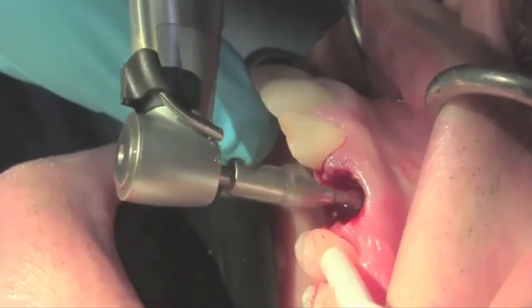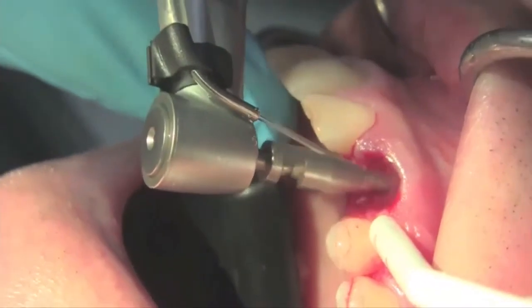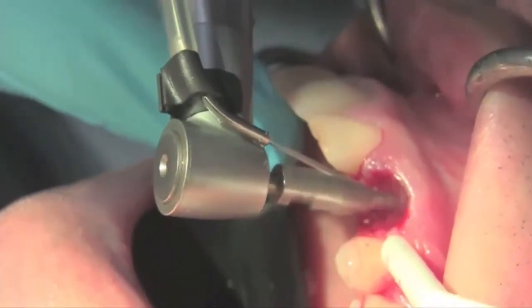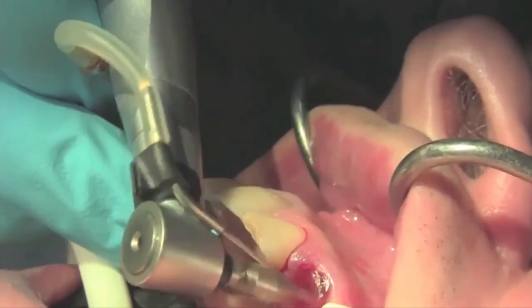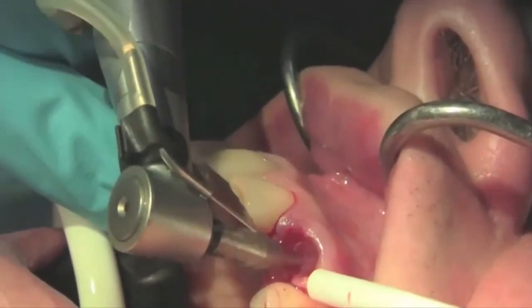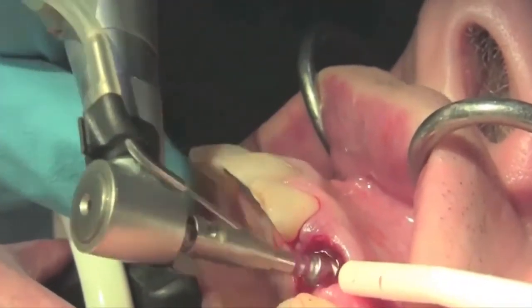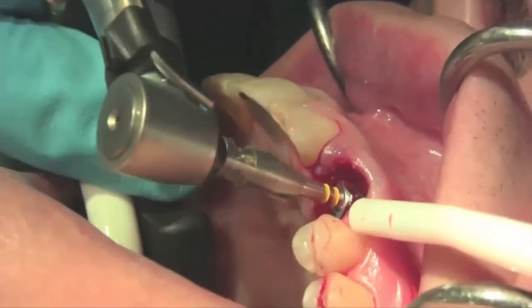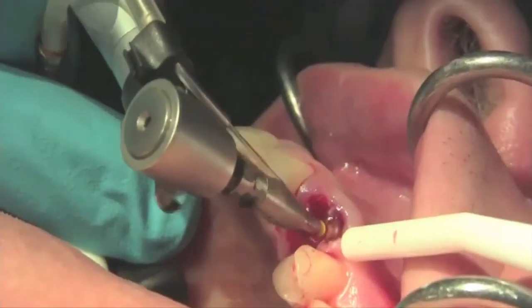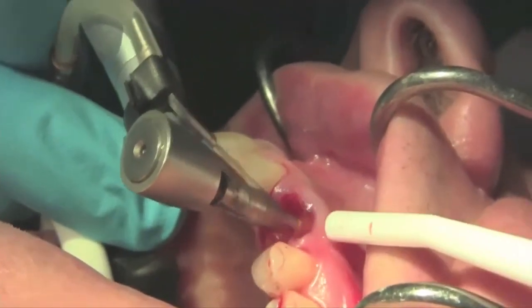At this point, we're doing the pilot perforation, and remember that we're trying to change the angulation from the angulation that the tooth had before, because if we just follow the angulation of the root, we would perforate and end up placing that implant on the facial area. So basically, we are preparing the implant site at an angle, following the sequence of burrs for the co-access system of the Southern Implant Company.